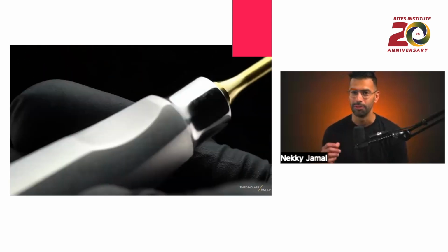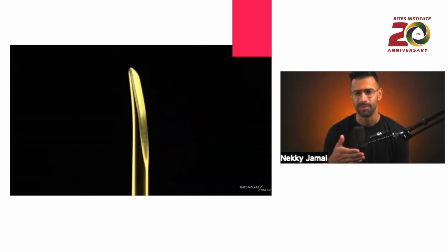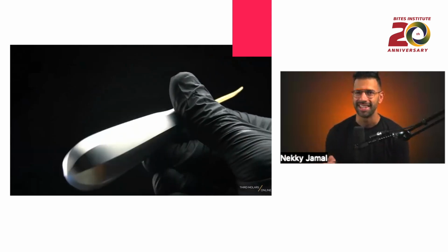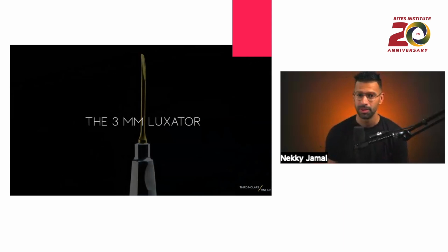It's my 3 millimeter luxator. I think a 3 millimeter luxator is the perfect instrument for third molars because the tip is thin enough that it can get right in between the tooth and the bone, and I can usually get a good purchase where I can pop that tooth out of there. So I'm a big fan of a 3 millimeter luxator.